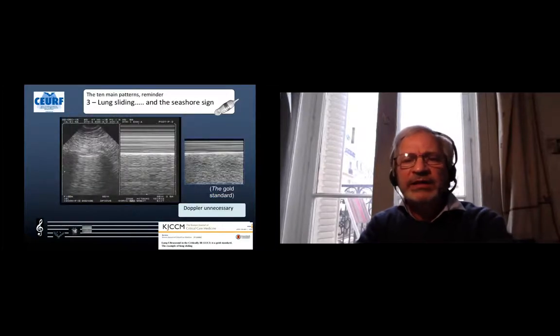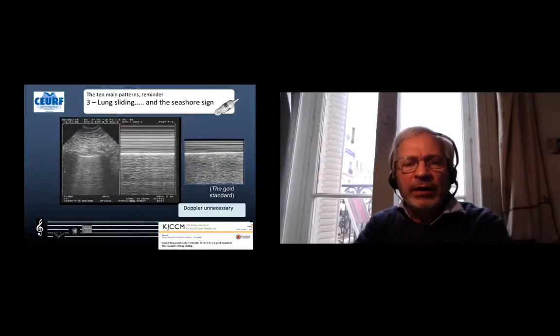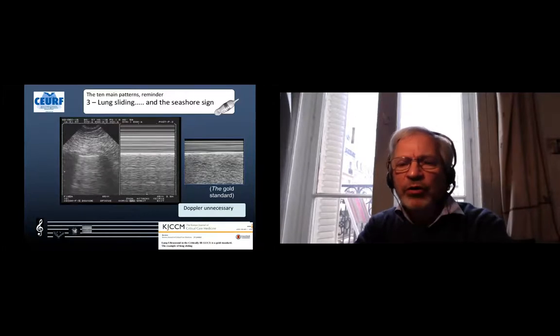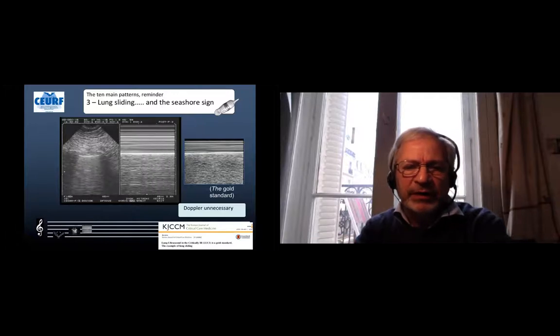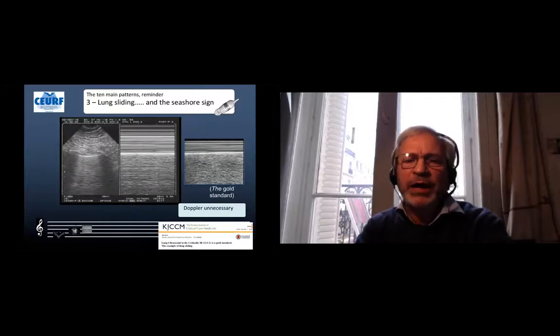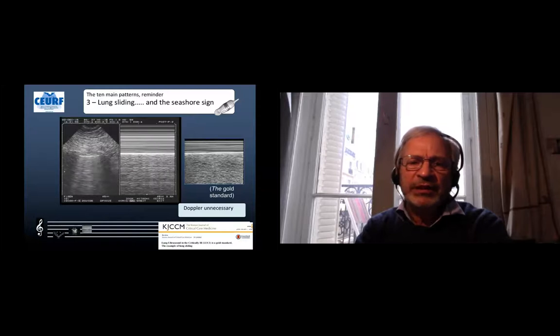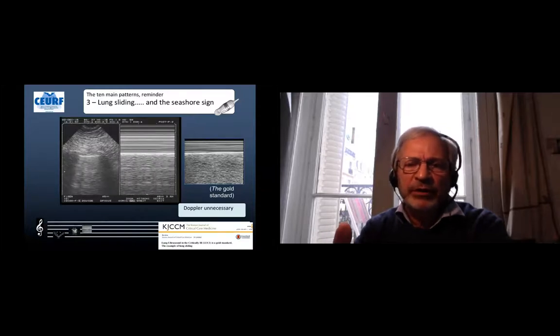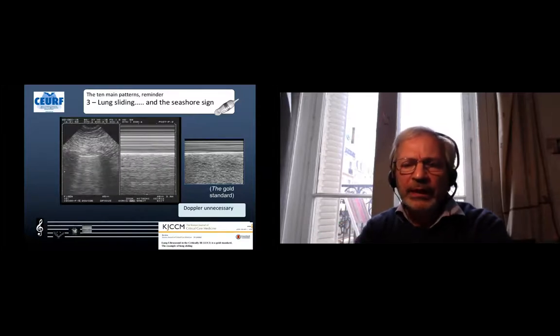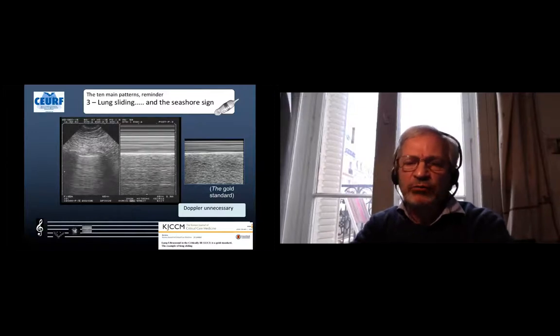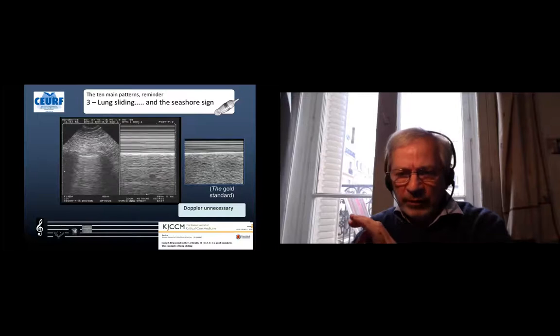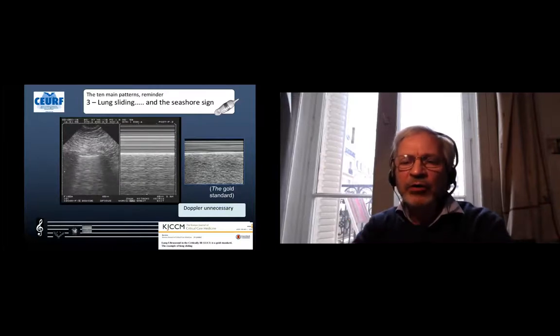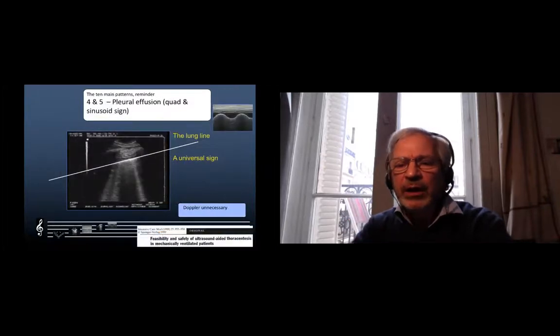The lung sliding can be seen on real time and also on M-mode showing this sandy pattern below the pleural line with a kind of stratospheric pattern above, that is the seashore sign. We don't need Doppler for having the certitude that we have correct lung sliding. We go rapidly on the pleural effusion.